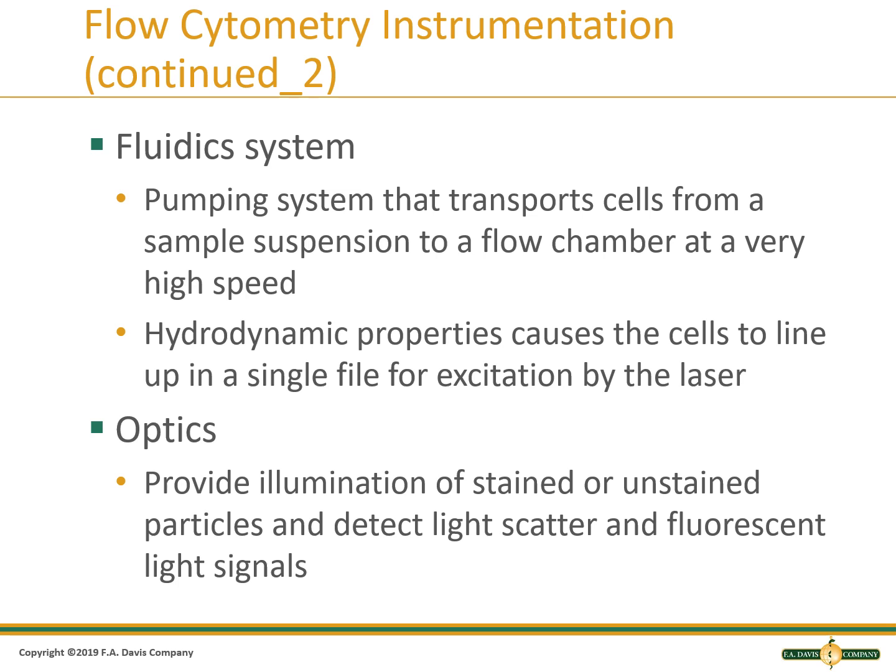The fluidic system is a pumping system that transports cells from a sample suspension to a flow chamber at a very high speed. The hydrodynamic properties cause the cells to line up in a single file line for excitation by the laser. Then you also have the optics system, which provides illumination of stained or unstained particles, and it detects the light scatter and fluorescent light signals.